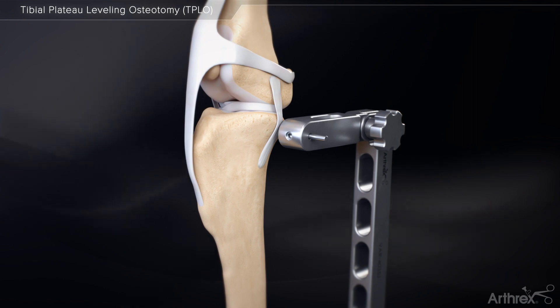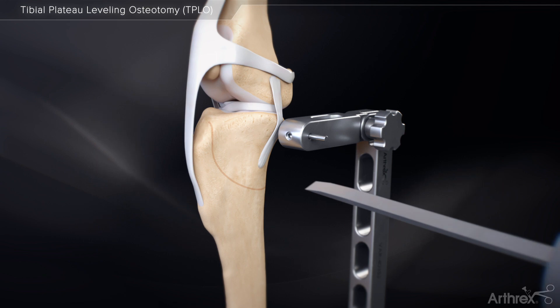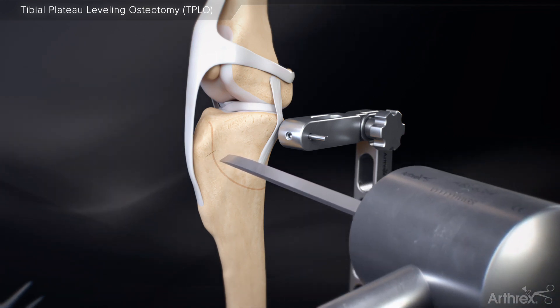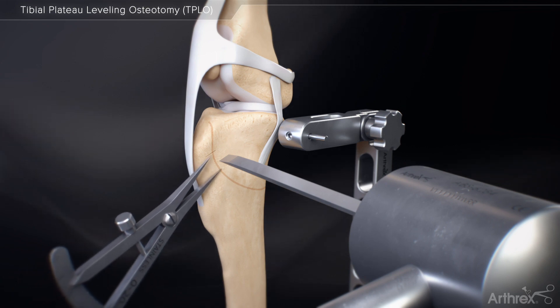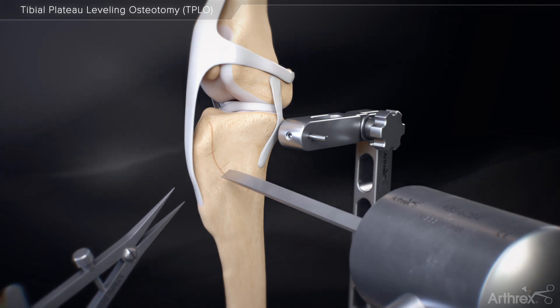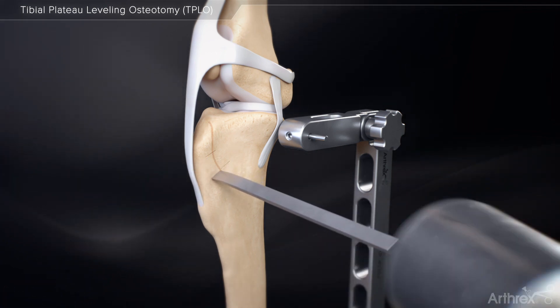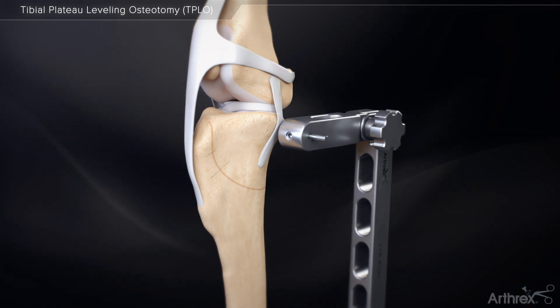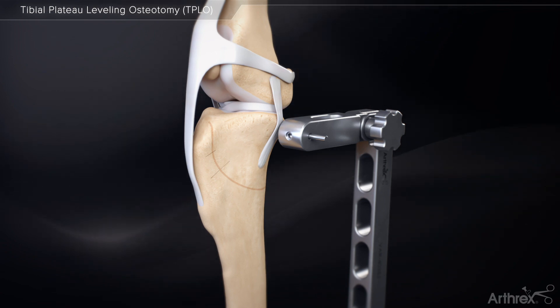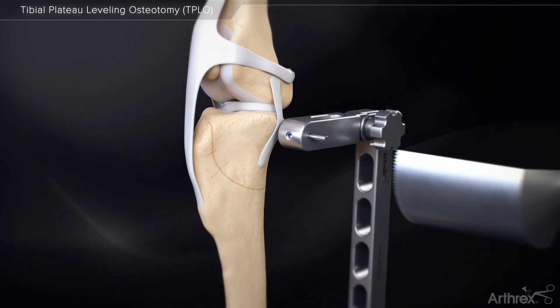Score the bone with the appropriate size saw blade determined from preoperative planning. Place a mark on the proximal bone fragment near the edge of the osteotomy, cranial to the midpoint of the osteotomy. Make a second mark on the proximal bone fragment at the proper distance from the first mark determined from preoperative planning, using a TPLO rotation reference chart. This mark should go across the score line to the distal bone fragment.